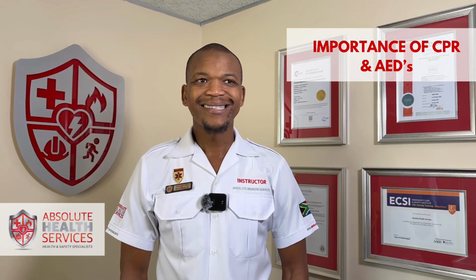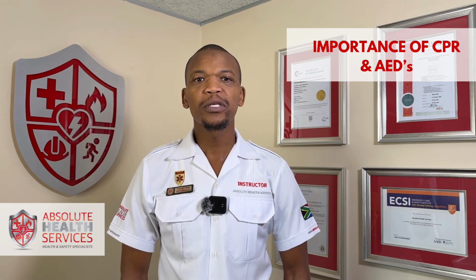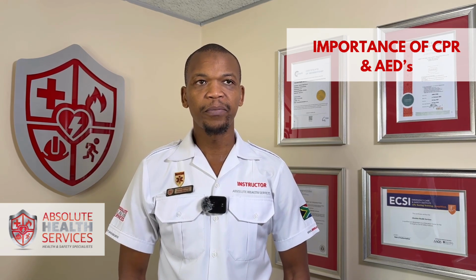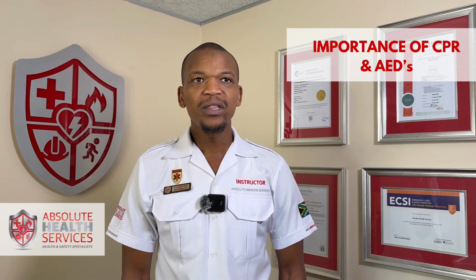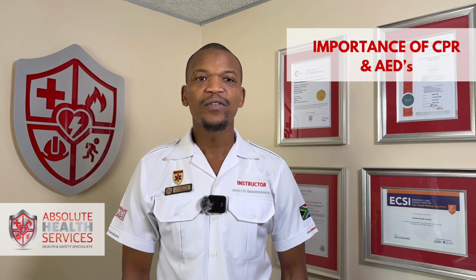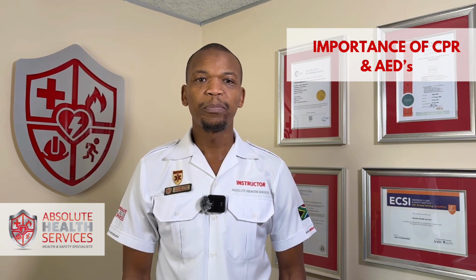So what does the CPR do? It is a manual mechanism that continues to supply oxygenated blood mainly to the vital organs, specifically the brain and the heart. So during this period, we ensure that there isn't room for possible brain damage, which may eventually lead to, worst case, a person dying. But the intervention of an AED actually increases the chances of survival of the patient by delivering an electrical shock to the patient's heart.